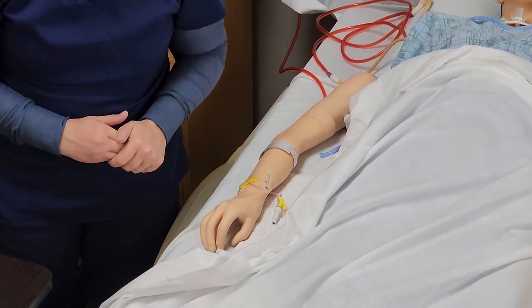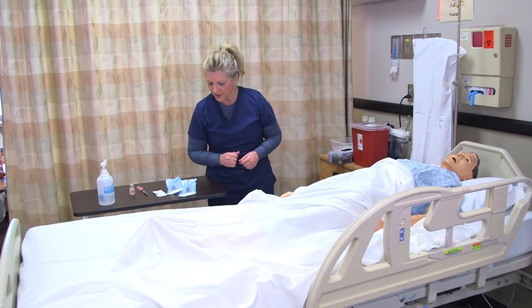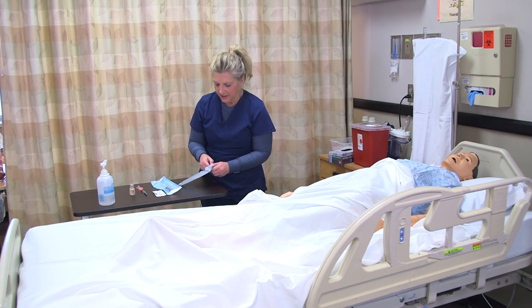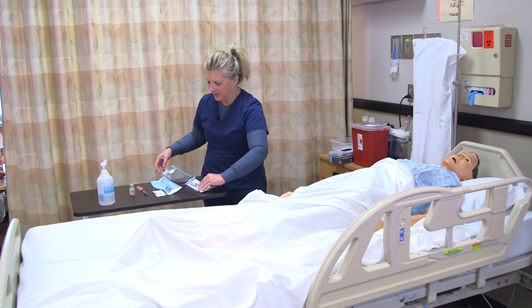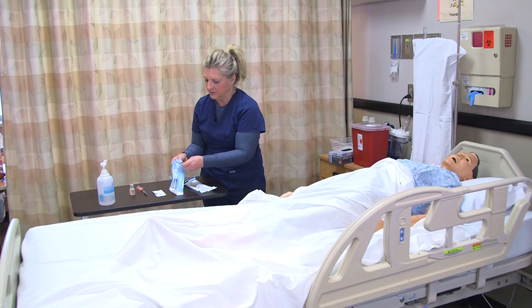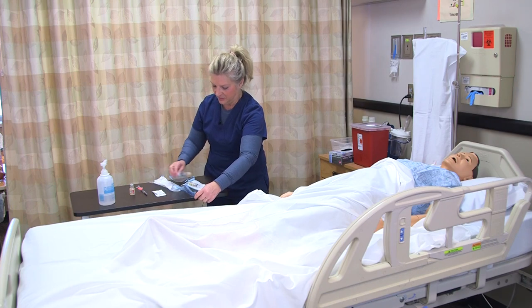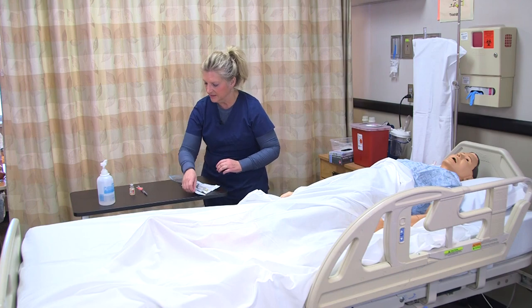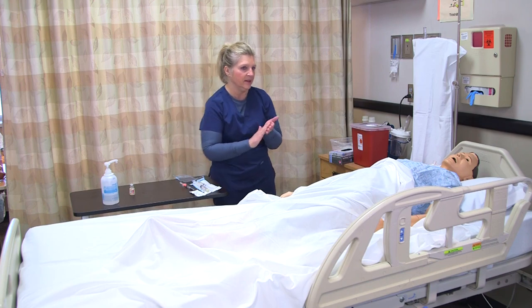However, I'm still going to check to make sure the IV is patent and that I'm able to push my medication through. I'll open up my supplies, check the expiration date on the supplies and saline flushes, and check against the MAR. I have both supplies open, my disinfectant, and my medication. I'm going to wash my hands one more time and apply gloves.